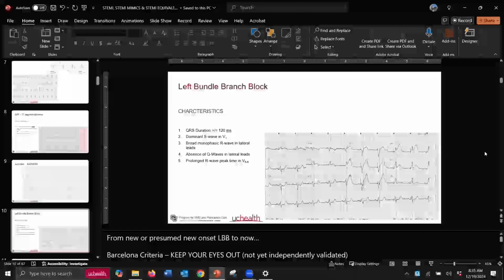And that's called syncytium. When that syncytium is delayed, we have a drop in cardiac output that may or may not be clinically significant. But I can look at that EKG and go, yeah, this patient's really got some compensability, versus, oh God, right? You've got a QRS duration of 0.24 seconds. It's taking half a day for that ventricle to contract, right? Your cardiac output, your inotropy is down. And they're going to compensate for a little bit, and they're going to crash right in front of your eyes.